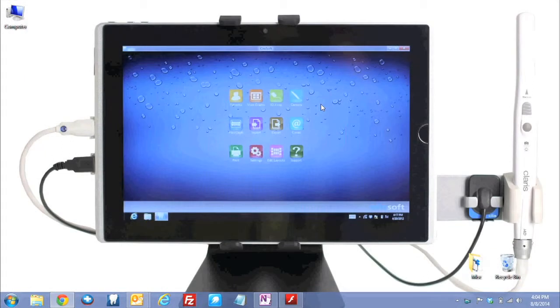Hello, today I will be showing you how to install the Claris intraoral camera. The first thing we want to determine is whether your computer is either 32-bit or 64-bit.